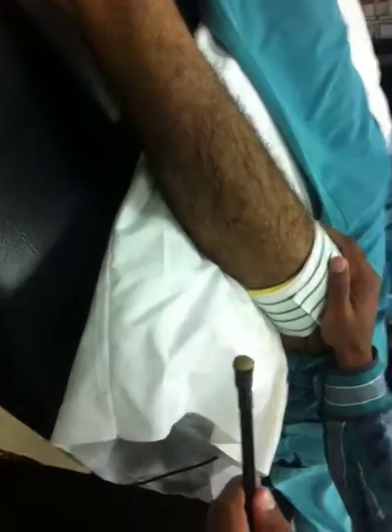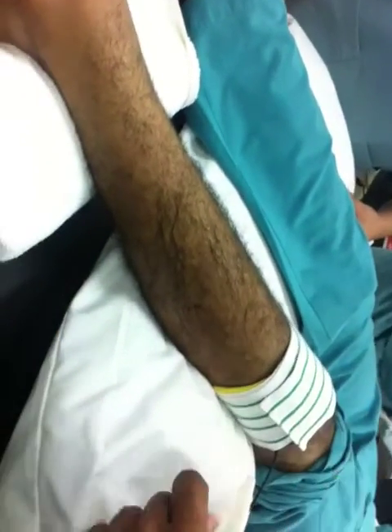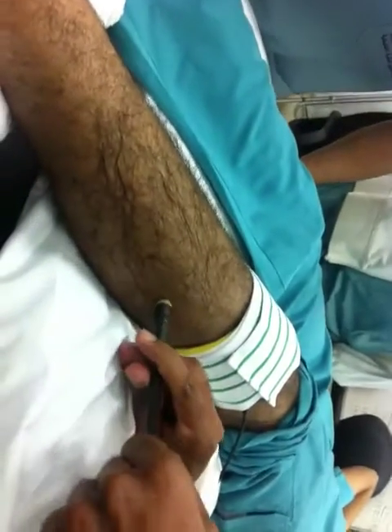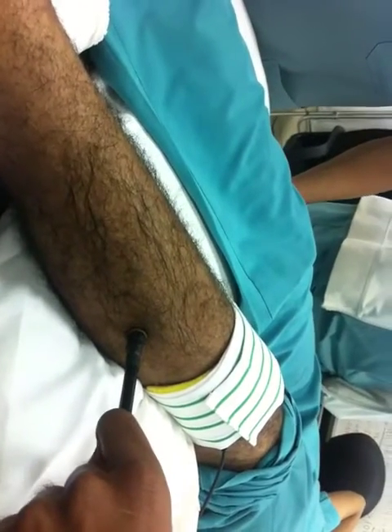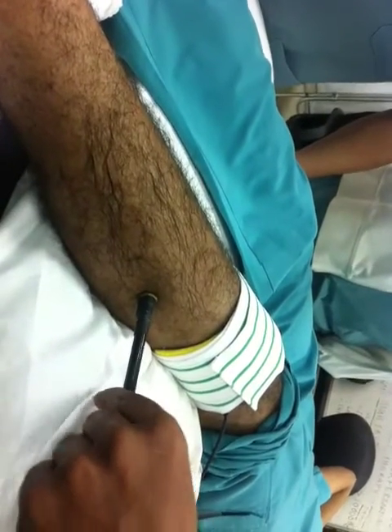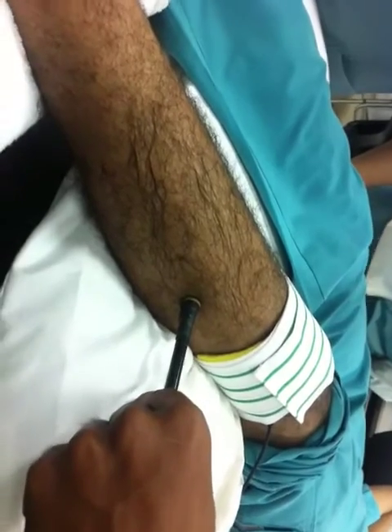Either you can keep a pillow or just a towel below the ankle — that's enough. We are going with this motor point for peroneus longus. What does peroneus longus do? It's eversion.